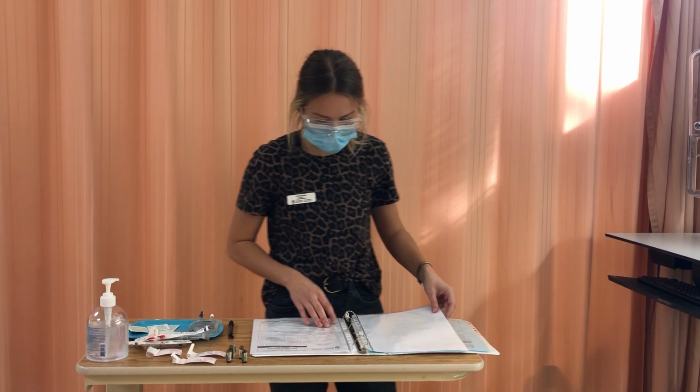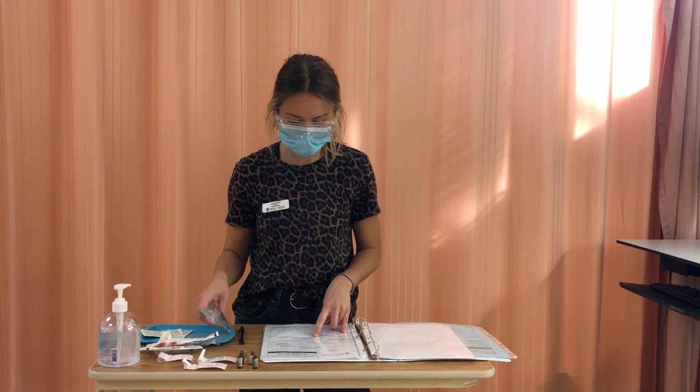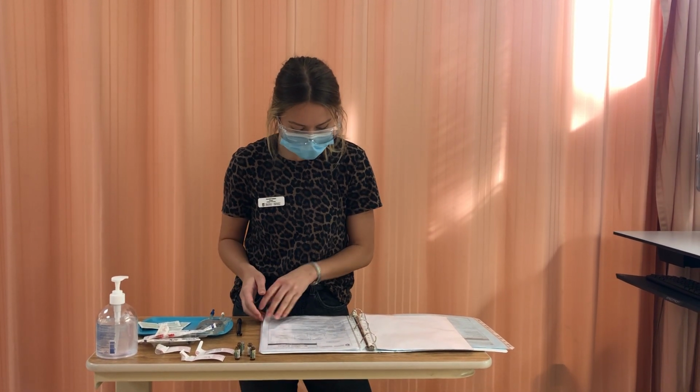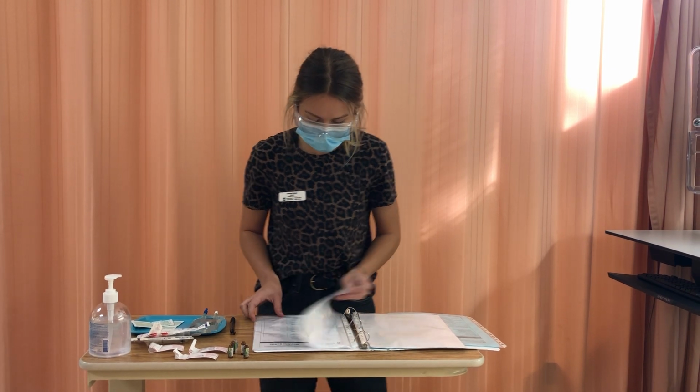I'm looking here at the normal dose, and the dose that's ordered is in the normal range. And it's compatible with normal saline, which is what I have here, what I'm going to be putting my morphine in. I'm going to be monitoring for any respiratory depression, nausea, vomiting, palpitations, any type of side effects. And I will be monitoring the vital signs and blood pressure pretty steadily.